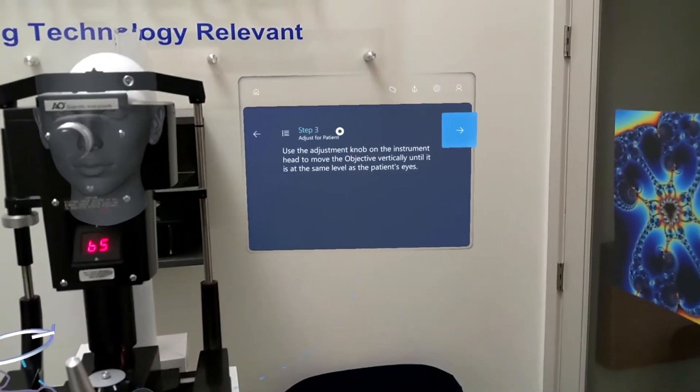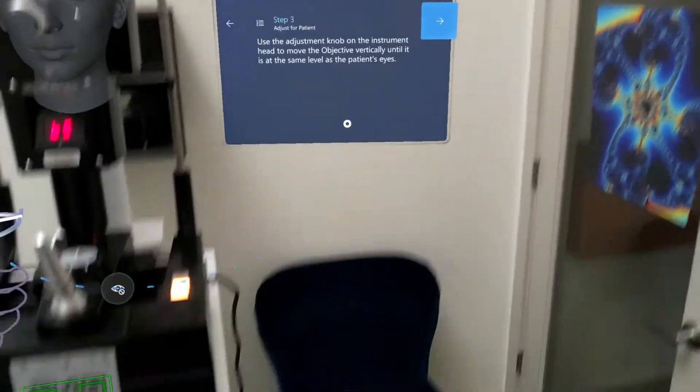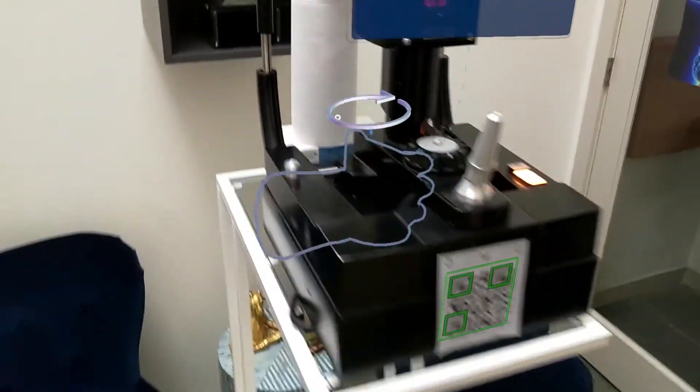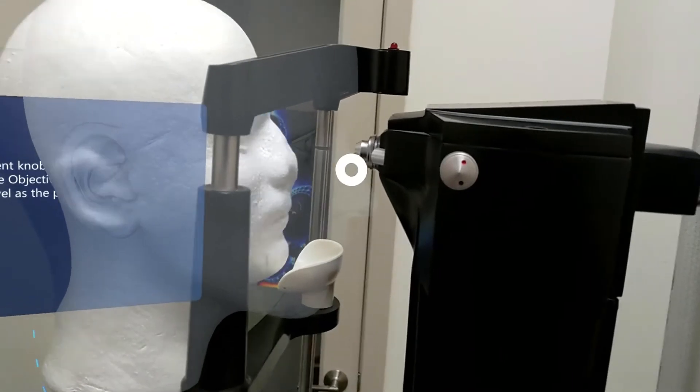Use the adjustment knob on the instrument head to move the objective vertically until it's at the same level as the patient's eyes. I'm being shown here that if I twist this knob, we should be able to raise this to the right level for this patient's eyes.